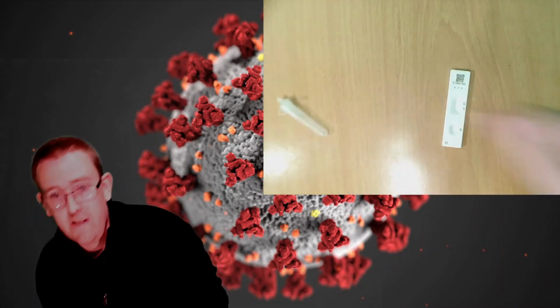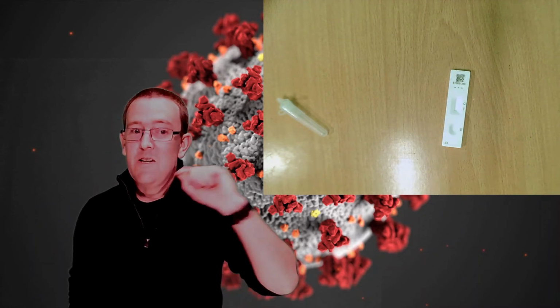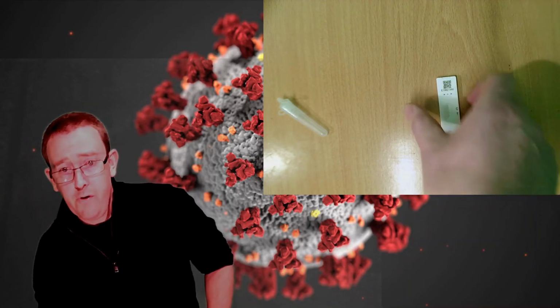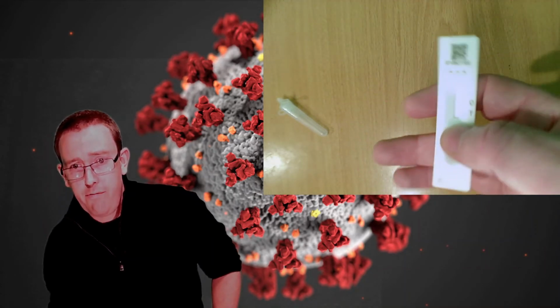The worst is when they're sticky. I hate that, right? Because you're supposed to do 2 drips, and some people have been very keen. It comes out in a little string, so you've got to be a bit careful about that if you're actually operating these. You'll then immediately see that it starts to move by capillary action, like if you've put your trouser leg in a puddle on a wet day, up from here, soaks up through into this window here.